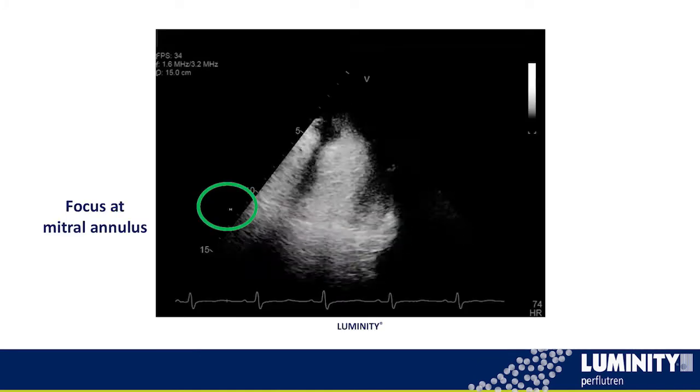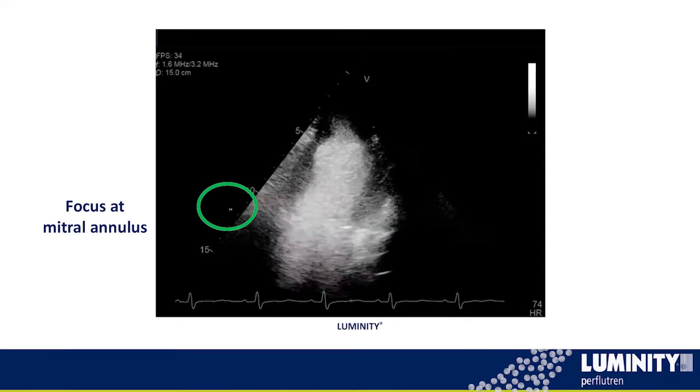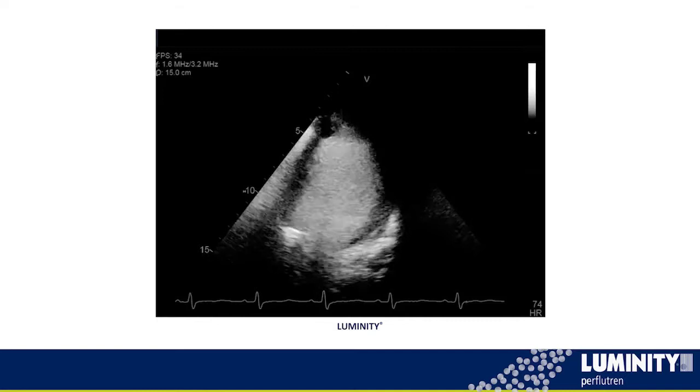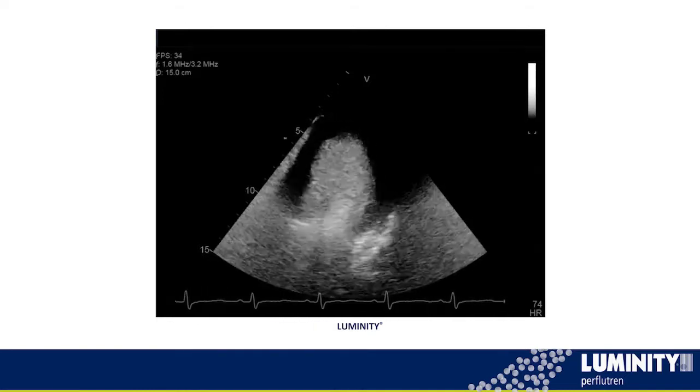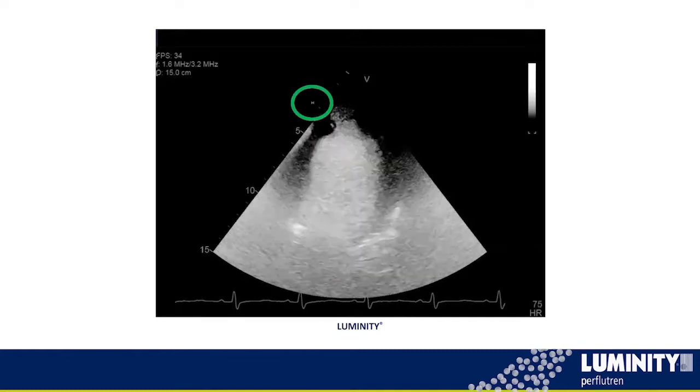One other technique that we can use is the focus. Right, so we always want to keep the focus around the mitral annulus level, but there might be some specific patients, if you're looking to focus on the apex, you might want to bring that focus up to the apex in that particular patient. In this example, you can see as I slowly increase the focus to more opacify the apex and then actually just change the gains, it's like a light bulb is turned on. It's a completely different window, right? So let's watch that again.